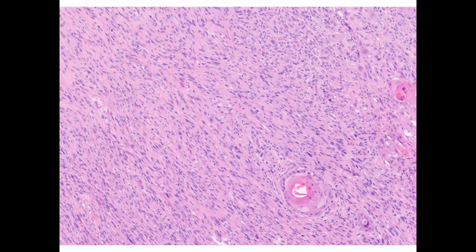Why do you have to rely so much on histologic findings? Because 30% of these will not stain for keratins. And at that point, they might stain for SMA, so the staining pattern might be confused for a sarcoma. These are squamous cell carcinomas until proven otherwise. That's the most common thing that it could be.